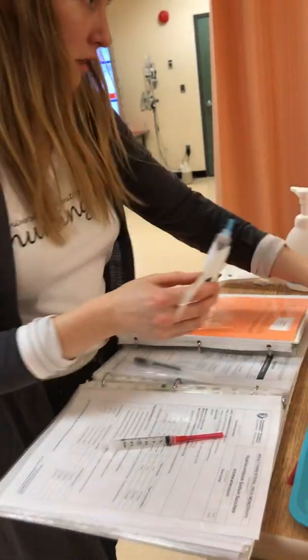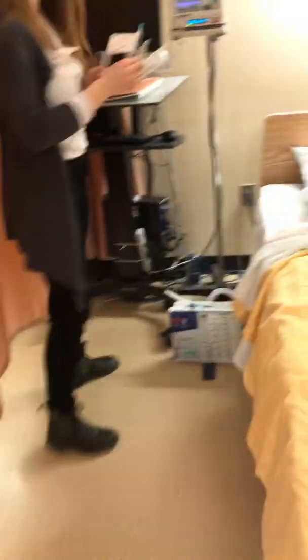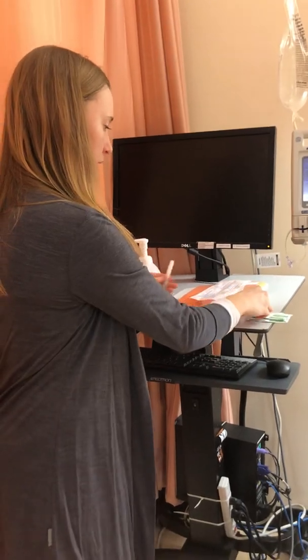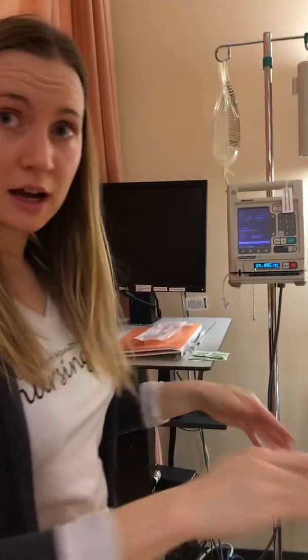I will grab this, and this, and I will move to the bedside, as well as this. Okay, so knock, knock, knock. I entered the patient's room. The first thing I'm going to do is wash my hands again with the hand sanitizer, do a safety check. Everything is looking good.